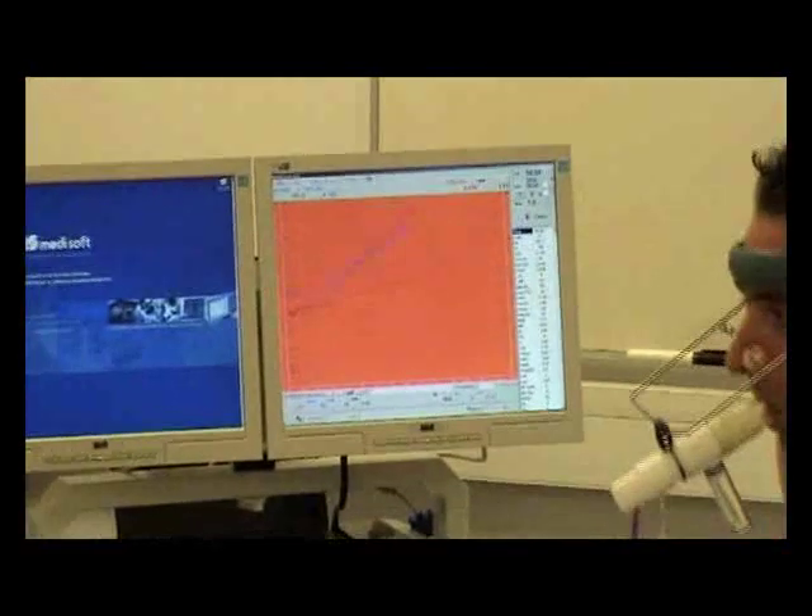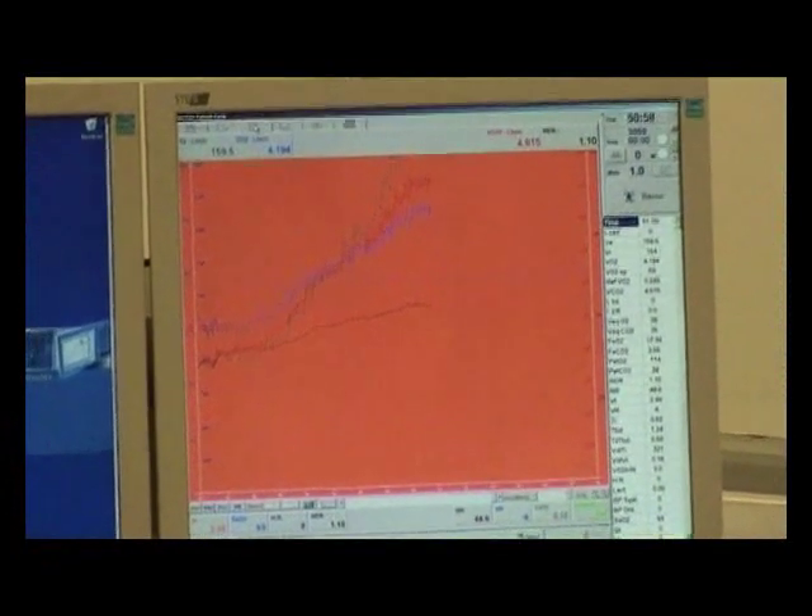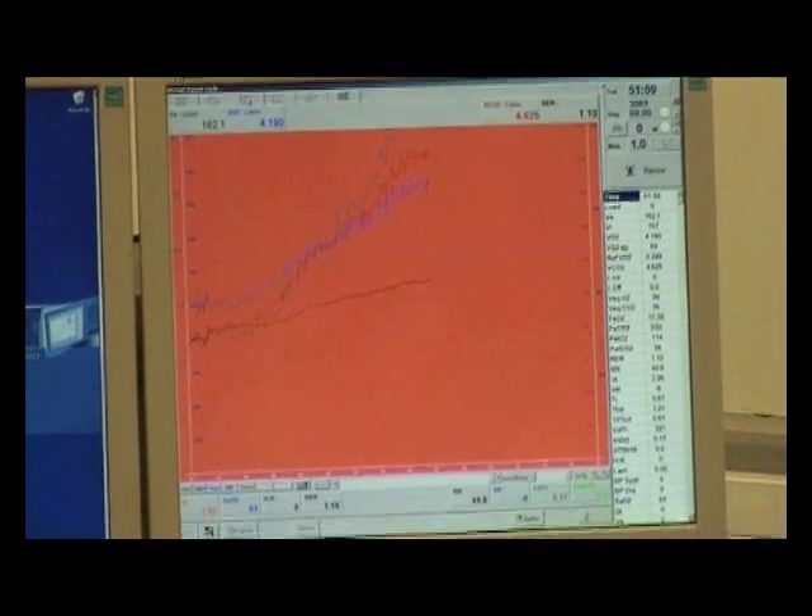The data also tells us that the test is coming towards the end. Look how the blue line is flattening off, demonstrating a plateau in oxygen uptake.